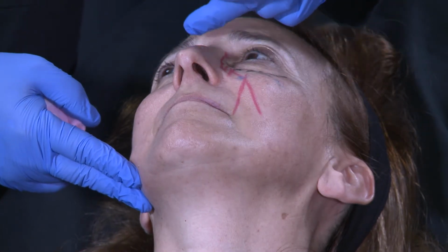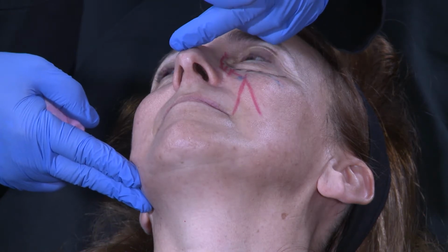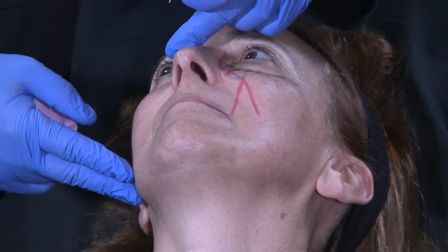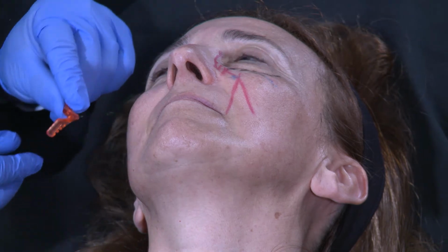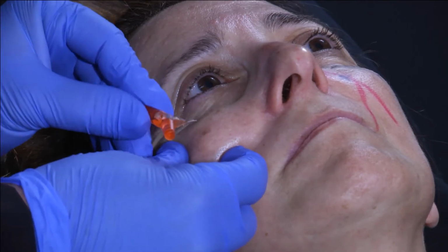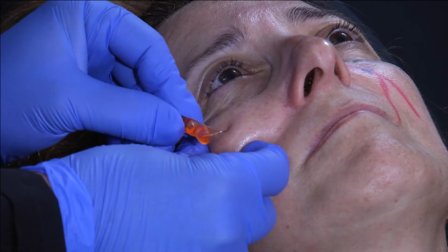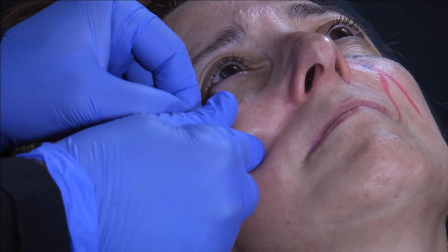When you have a bump on the nose, don't do injection, do surgery. But when you have a tear trough at the beginning, do an injection, don't do surgery. So here, I don't know if you see that very well on the camera, I will use an easy guide. What is an easy guide? It's a very clever tool to reach, you see my bone here.